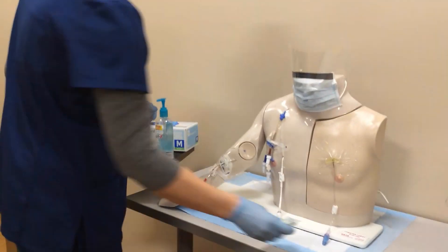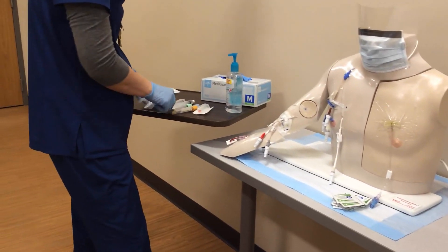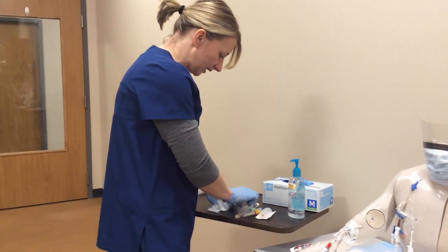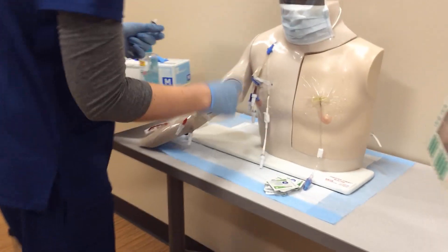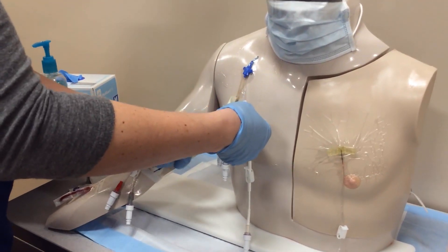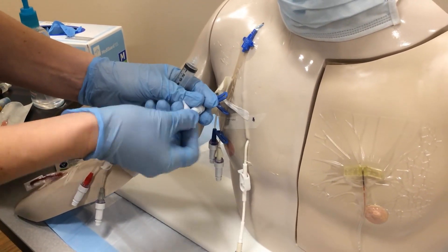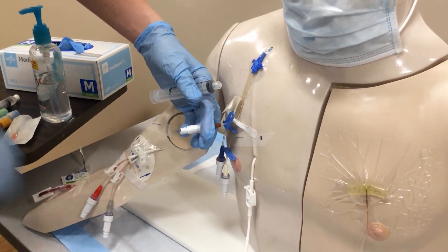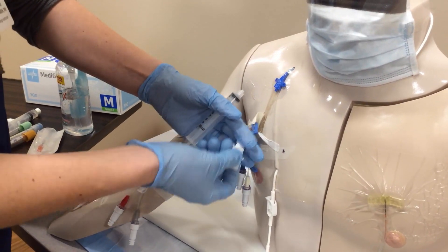I'm going to be using plenty of alcohol swabs. I'll open up my syringes — I need two 10cc syringes. The first one is to draw back blood that I'm going to waste, to clear whatever medications could be in that line. I've made sure all other clamps are clamped before I start, and I'm going to clean off the end of the line. I might have touched the end, so I'll clean it one more time because my finger touched it when I went to grab my syringe.